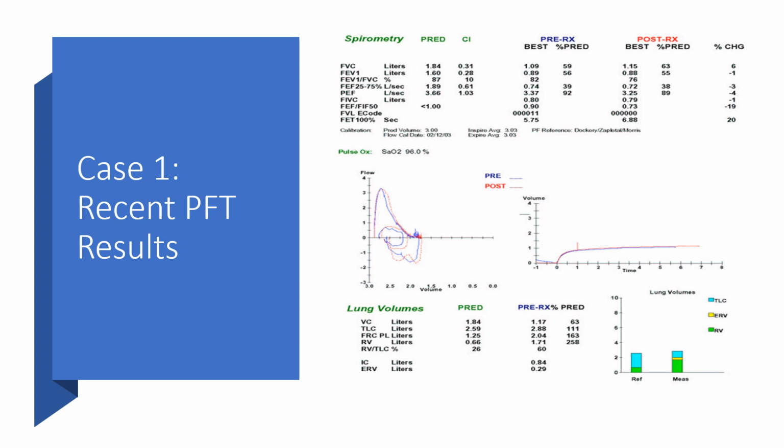So in this particular patient, you have decreased flows, but they're not responsive to bronchodilators. I'm taking a lot of information in this slide, and I'm trying to simplify it. And then going down to the lower left, with one exception, you also have fairly significant hyperinflation. So let's take a closer look in the ensuing slides at the interpretation.